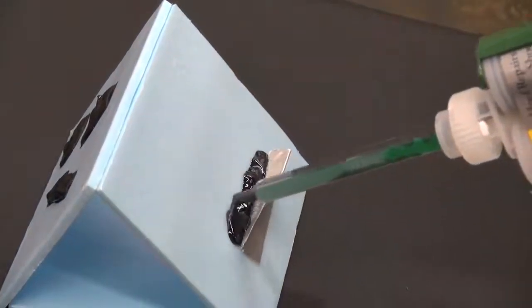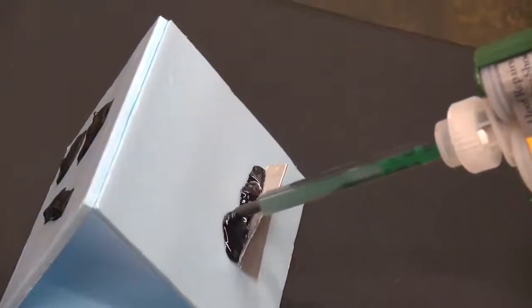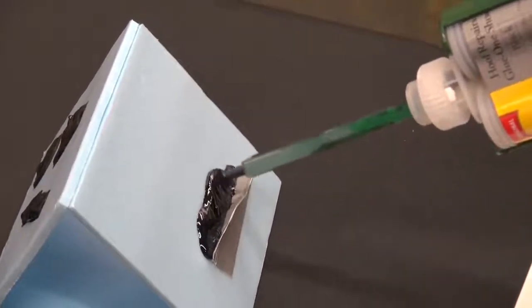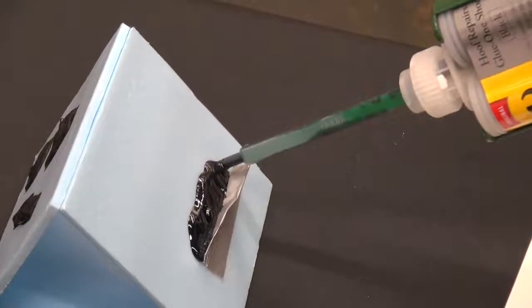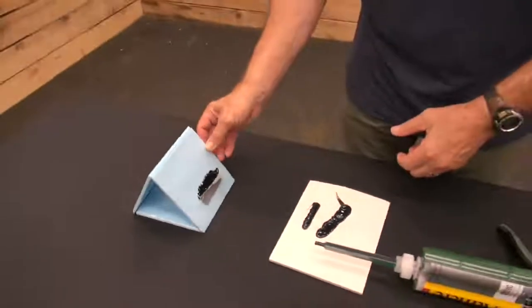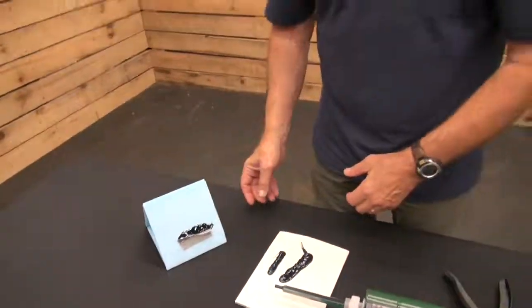And once we've got that base bead set up, we can start building on top of it and go up without the material having to slump down. So that's an easy way to control flow and to fill a defect without wasting material and having it slump down to the ground and getting rasped off.